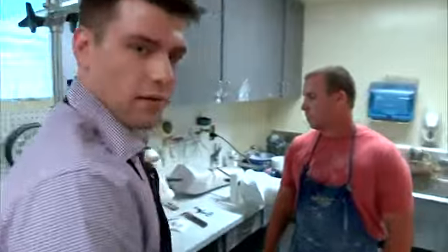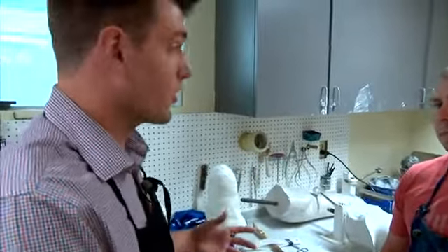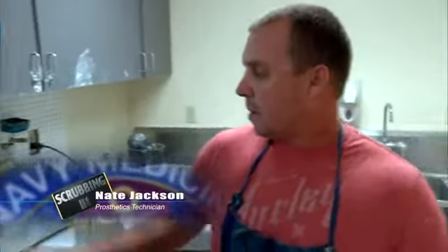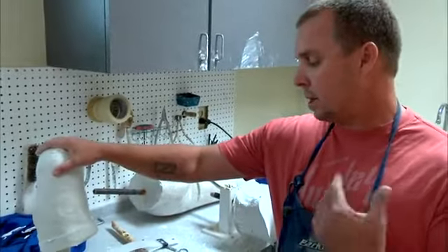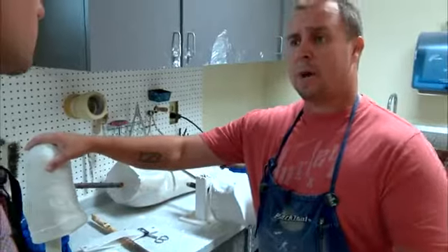We're going to do the next step in the process — filling the mold that we just made. After the process takes an impression of the patient's limb, the next step is to fill this mold. As a prosthetic technician, I'll take it back to the plaster room and we'll start the process of filling the mold.